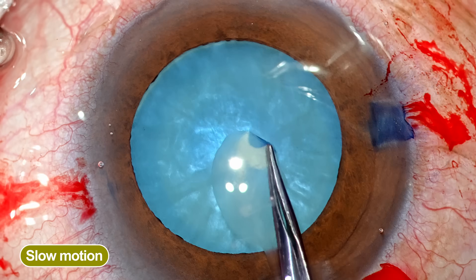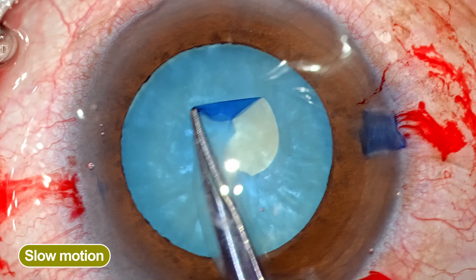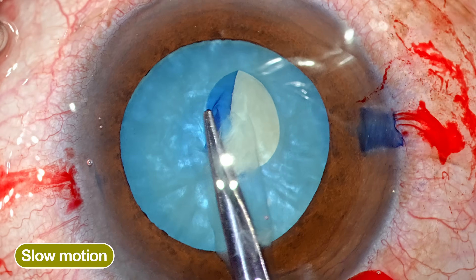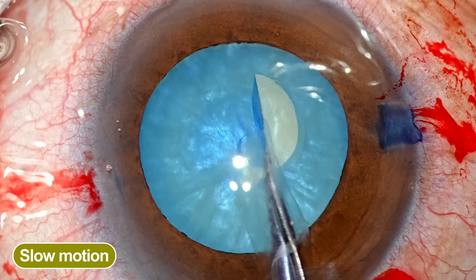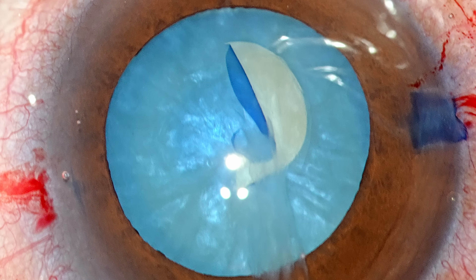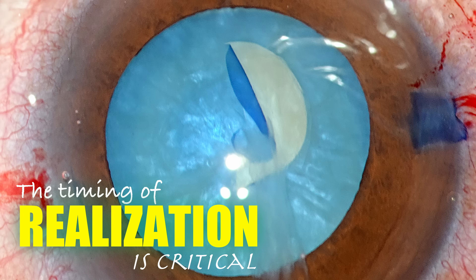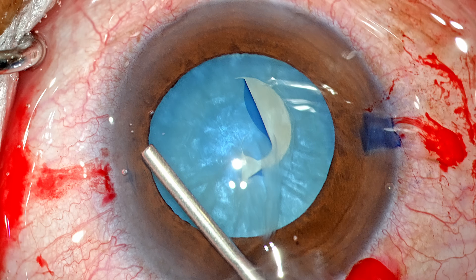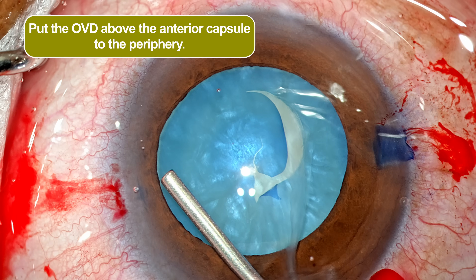Let me rewind and examine the rhexis part in slow motion. There are certain moments where you have to be alert and proactive. The moment I lift the flap and perform the rhexis — after the first point — I can see that the tear has already changed direction. Pausing here, you can see the trajectory was clearly heading directly towards the opposite equator. Timing of realization is very critical. At this point I stopped, and I put in OVD — but importantly, I am not putting the OVD in the center of the capsule bag or under the capsule flap.